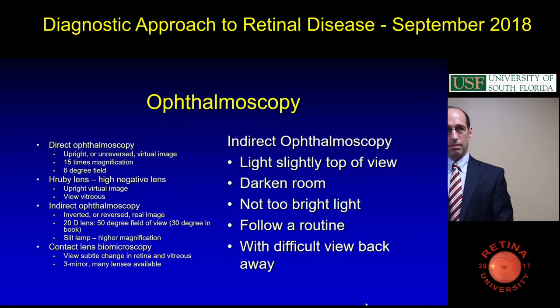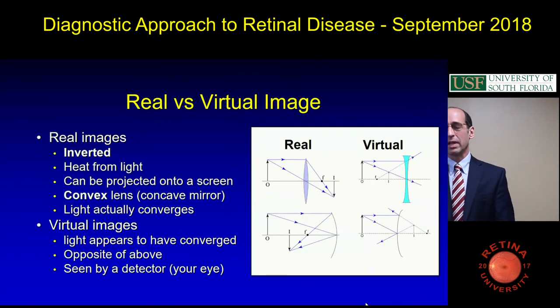Keep the lens still. Yeah, keep the lens still. You can move it back and forth. I have a thing in here on lenses. Yeah, I have a thing on the different lenses.